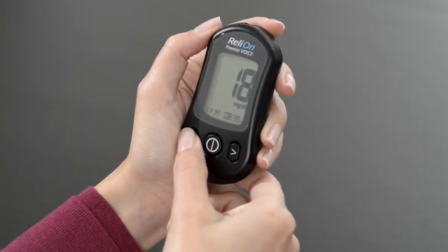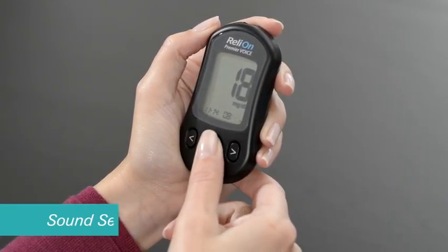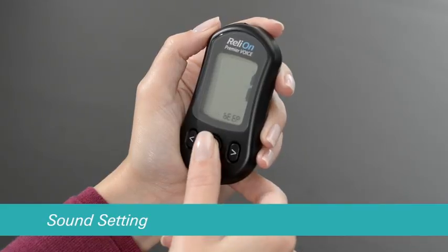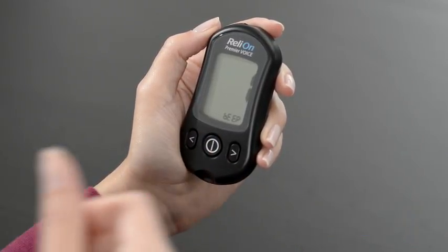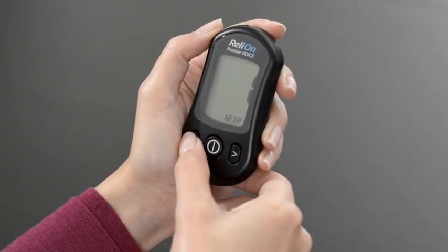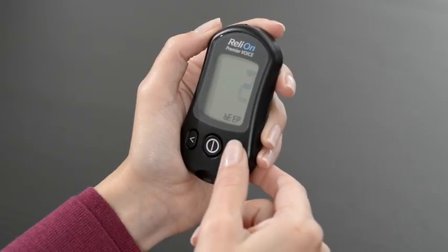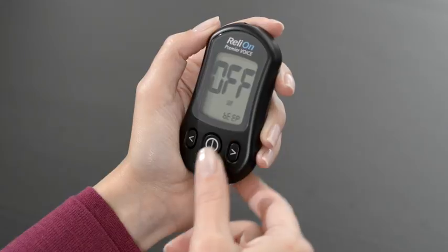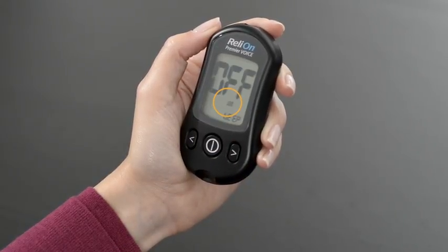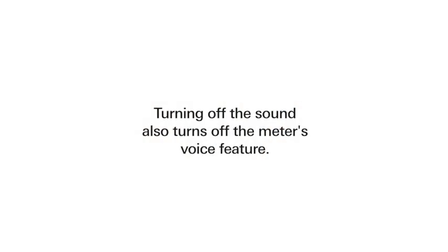Then press the center button to proceed to the sound setting. Use the left or right arrow buttons to set the volume and turn the sound on or off. When the sound is turned off, a mute symbol will be displayed. Turning off the sound also turns off the meter's voice feature.